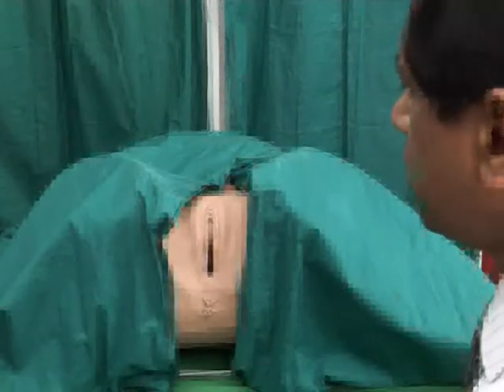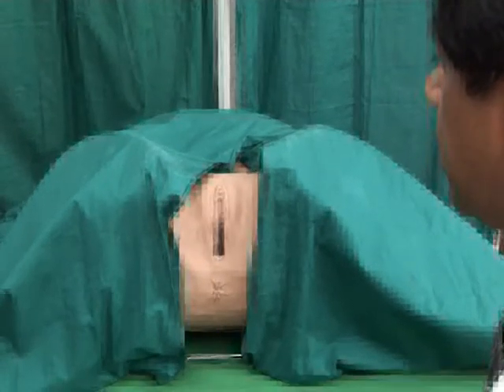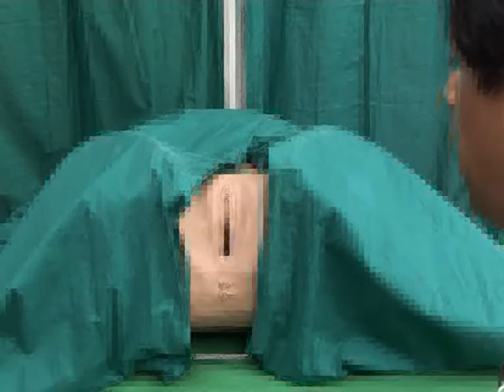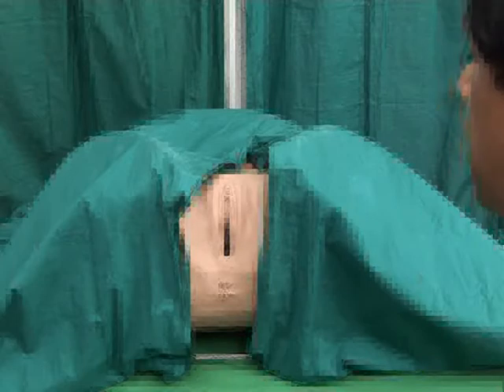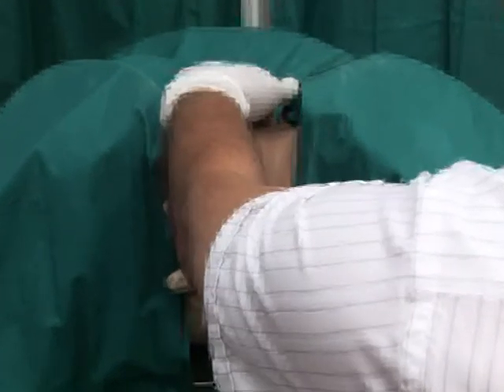For the insertion of the intrauterine contraceptive device, you need to keep the patient either in the dorsal position or in the lithotomy position. Prior to insertion, it is important to do a digital pelvic examination to exclude any pelvic pathology, including infection.